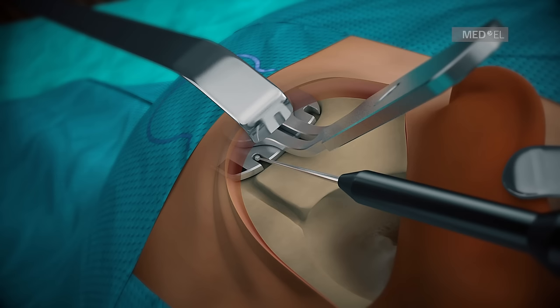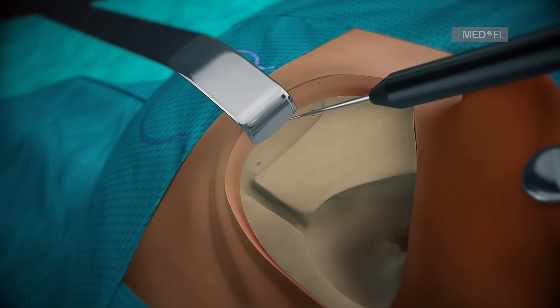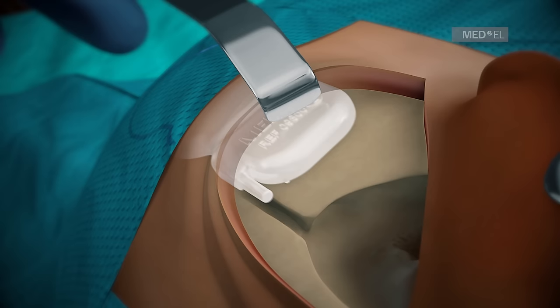There is no need to drill perpendicularly. Remove the drilling template and enlarge the pinholes. Insert the implant template pin to double-check for the correct position of the implant.